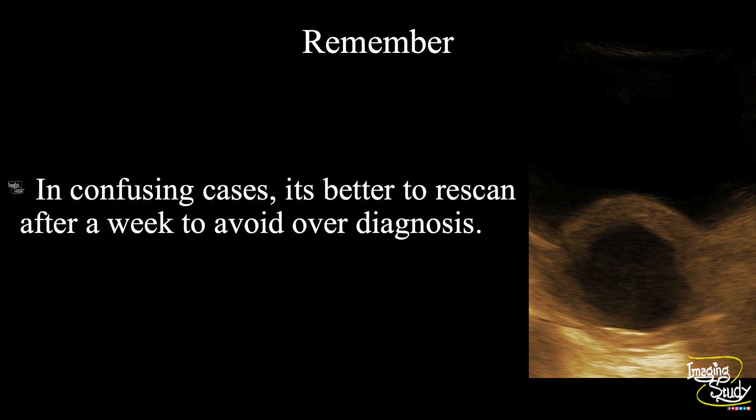The take-home message: usually in transabdominal ultrasound, if you don't see any embryo after more than 25 millimeter mean sac diameter, then it will be counted as a blighted ovum. In confusing cases, it's better to re-scan after a week to avoid over-diagnosis.